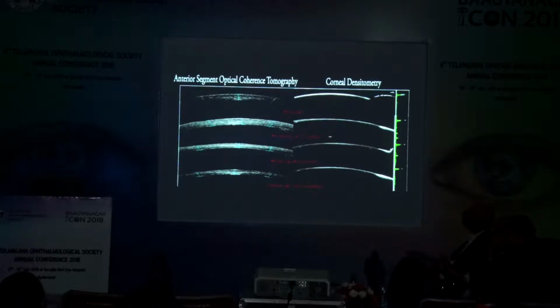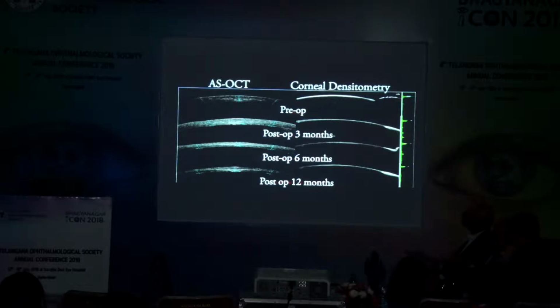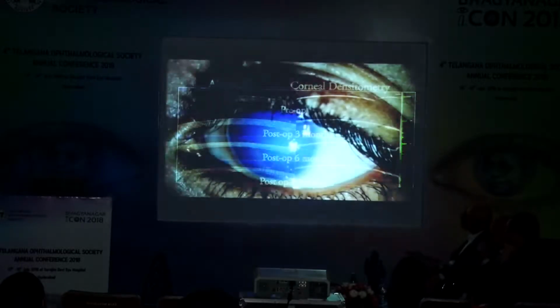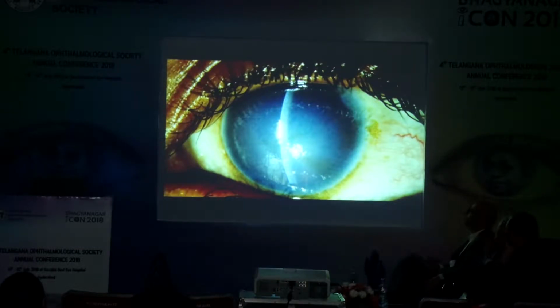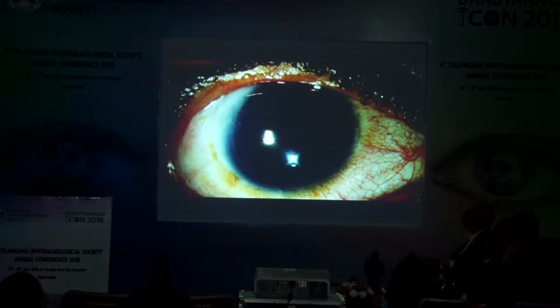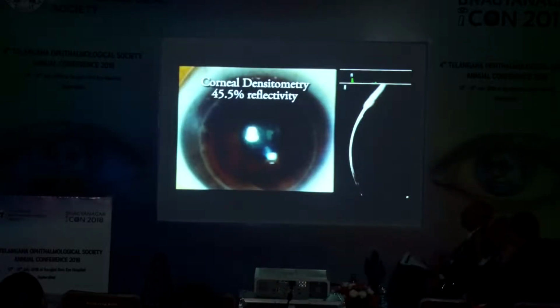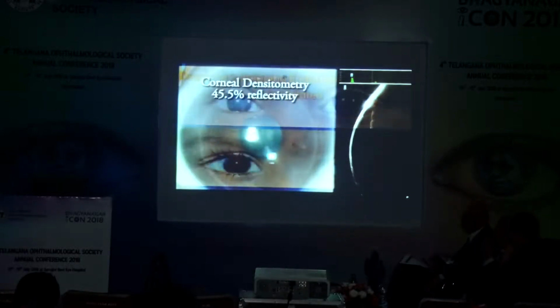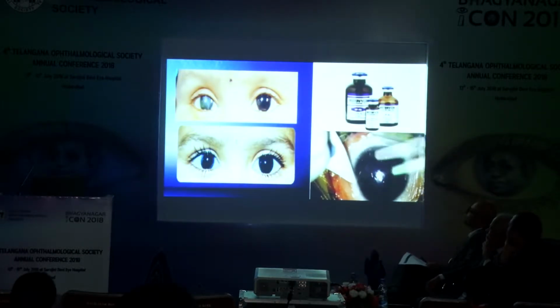Postoperative anterior segment OCT and densitometry measurements allowed us to qualitatively measure the graft-host dynamics and corneal clarity, maximizing the visual success during the rehabilitative journey. To conclude, children with visually significant stromal opacification in cases of CHED can achieve excellent visual outcomes and realize a significant improvement in corneal transparency by undergoing simple, non-Descemet stripping endothelial keratoplasty in conjunction with superficial keratectomy and use of mitomycin C.